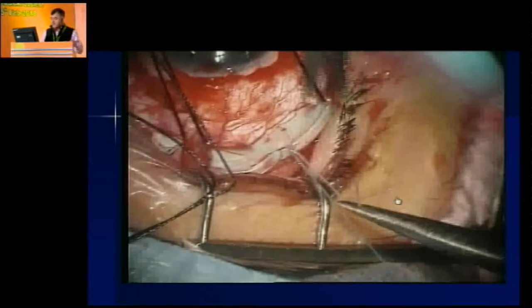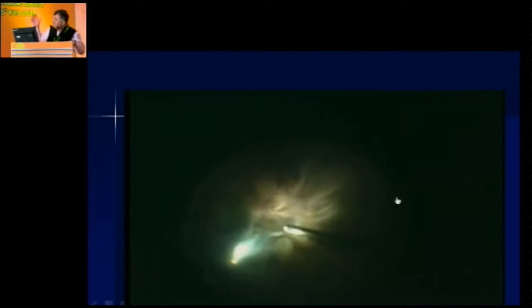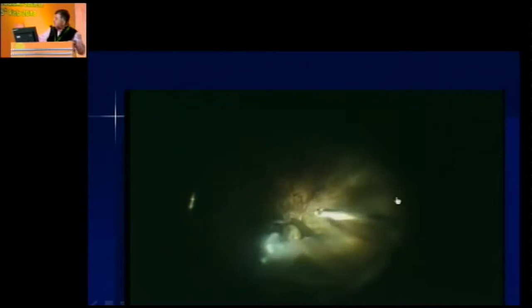And this is the case which I had shown, that closed funnel. Now you see, it is just like a plaster. You will not even look at this eye. But I had to look at this eye. This child, I still remember, was brought with great difficulty, very poor. The other eye was phthisical. So you have no choice. You have to go in.